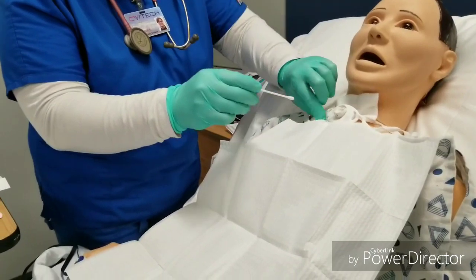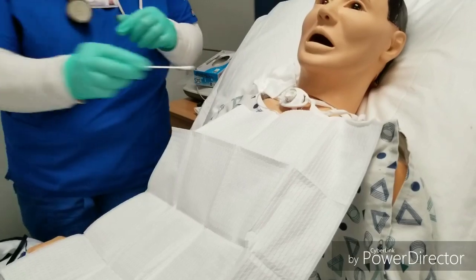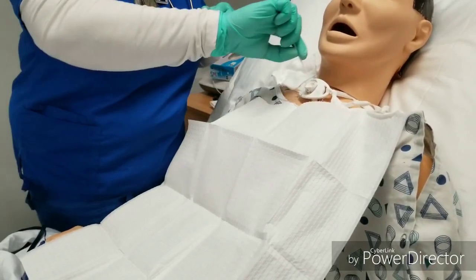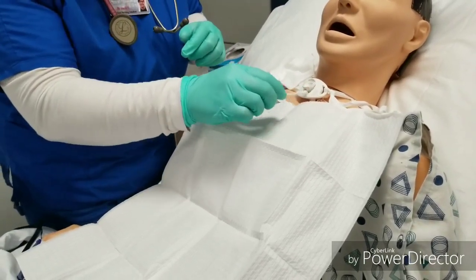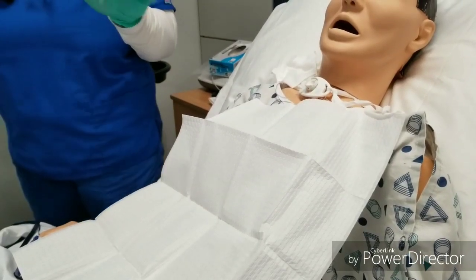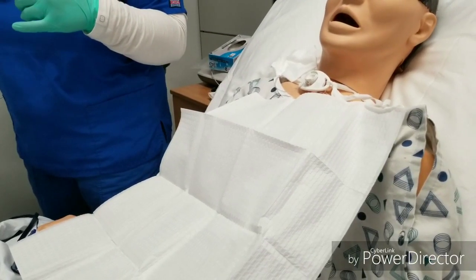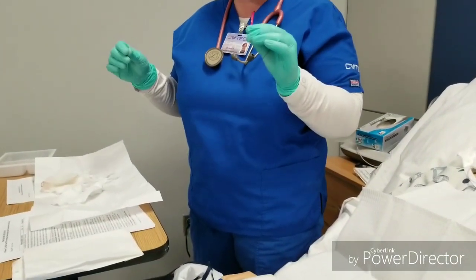Cleaning the skin. This would not be here. Clean, dispose, clean, clean, dispose, clean, clean, dispose. And you just want to make sure this is all good and clean and free of junk. If you notice before you even get started, your patient has a lot of secretions outside and you're going to need more Q-tips than what the kit provides, you can add another package of sterile cotton swabs.